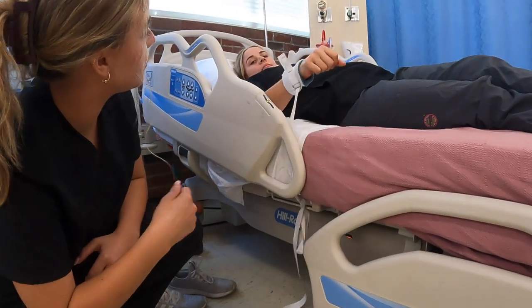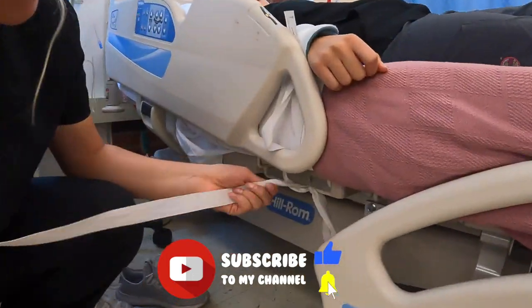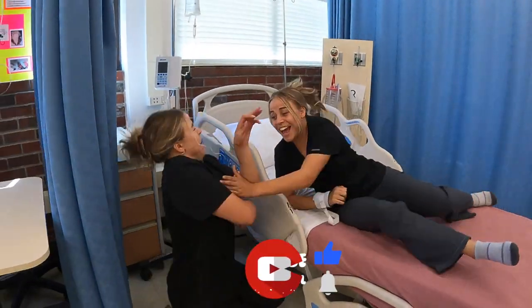Try to move around — see, it's tight. She's not gonna get out. But then right here, this little tail, it's so easy to pull out.